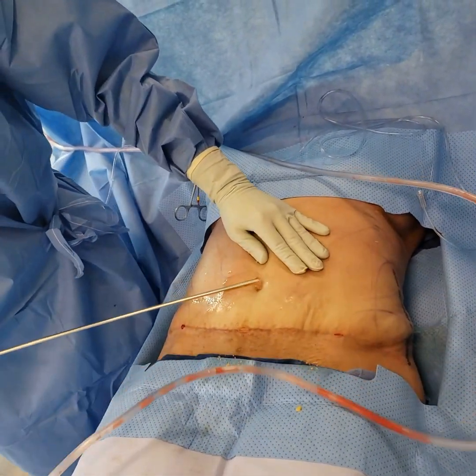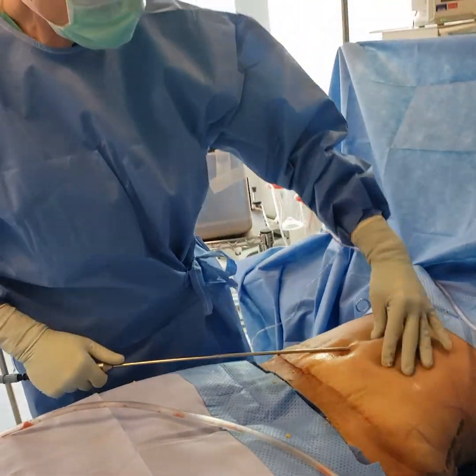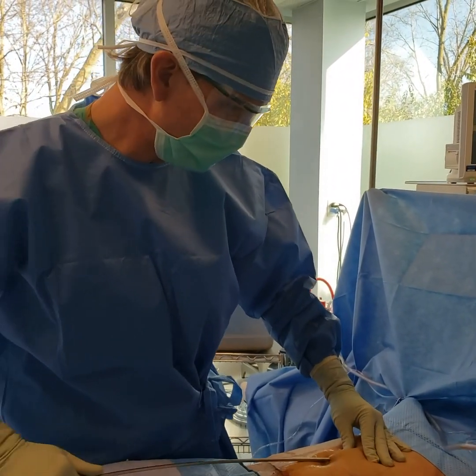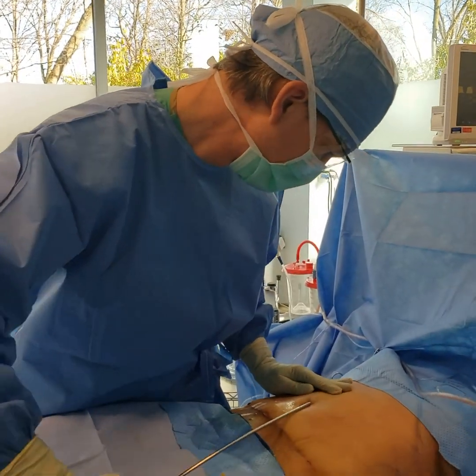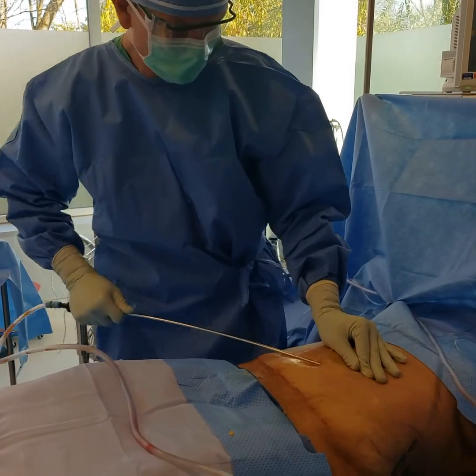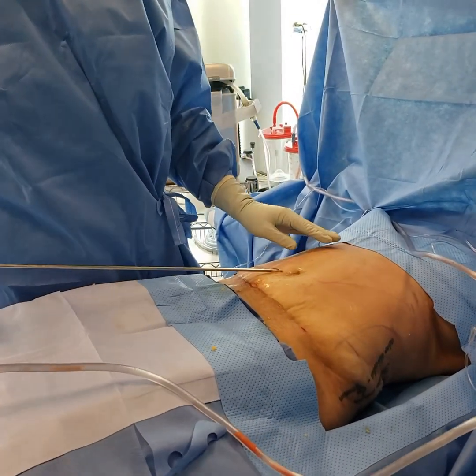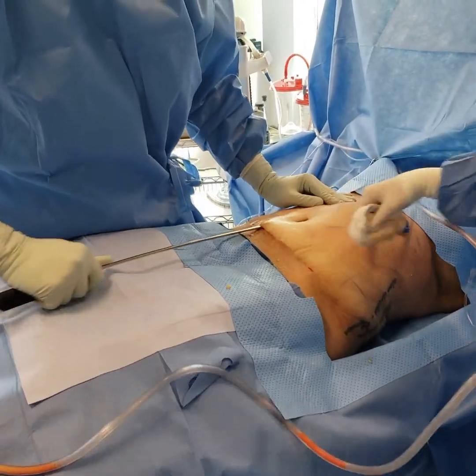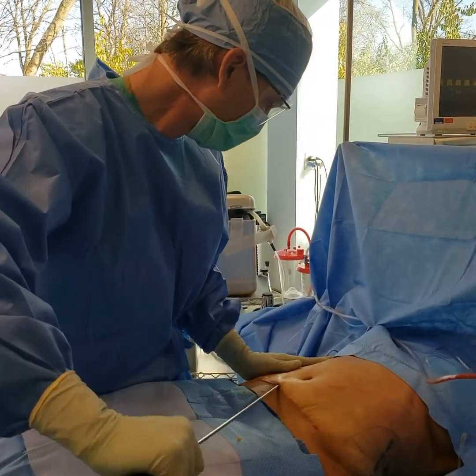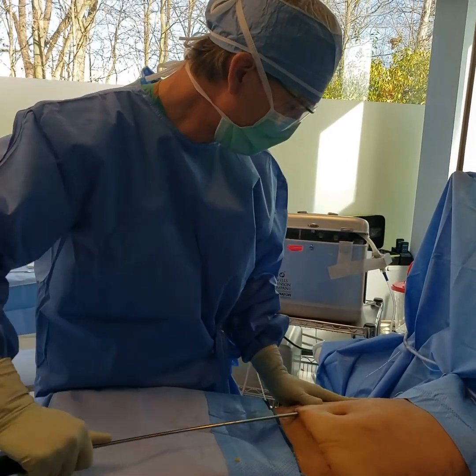But seromas are relatively common from liposuction, because if you think about it, you're taking all that tissue away and leaving a big open space. And the body, to get rid of that open space, it abhors a vacuum, like they always say in science. It fills it up with fluid first, and then the fluid can turn into scar tissue. This one is a lot different than the surrounding tissues. I'm going to work this left side here next. Break that up. Scar tissue when I get close to that central spot right in here.